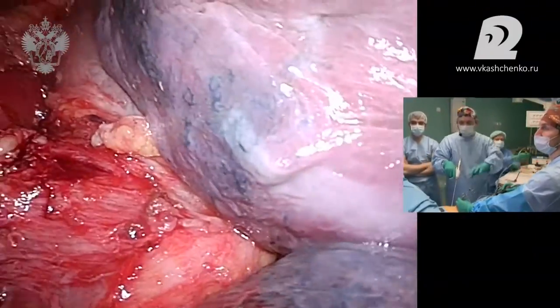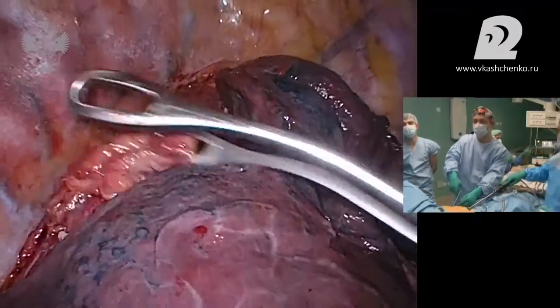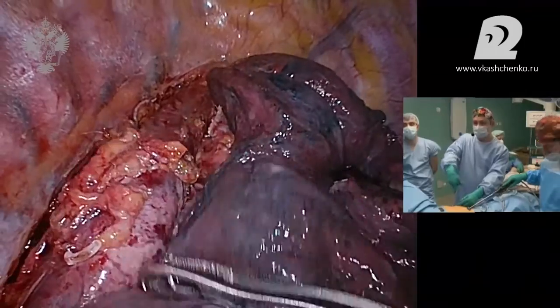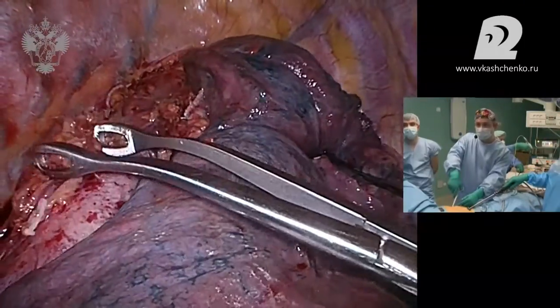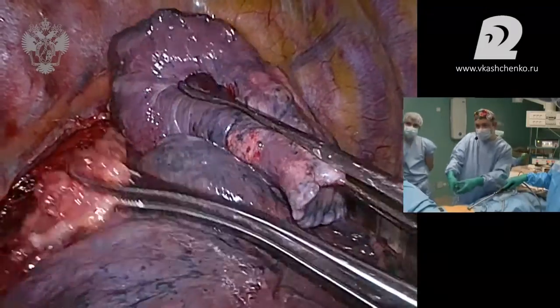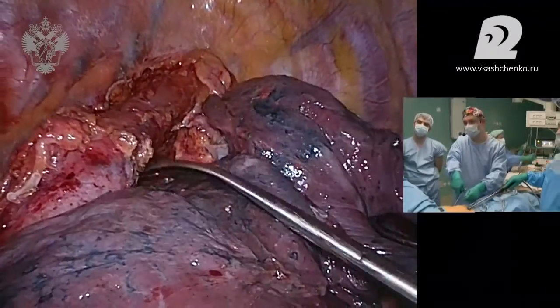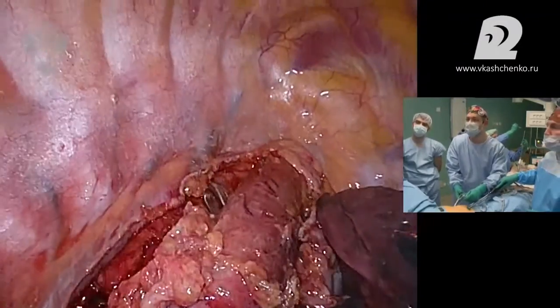Женька, подожди, это уже, наверное, вывернутая наизнанку обратная сторона. Назад ответим. Хорошо. Давай, заходи, братан. Пора уже, надо отсечь, конечно, наверху этот самый пищевод. Я тогда ее сейчас поставлю. Жень, это противоположная сторона, она уже хорошо сделана вся. Все, вот смотрите, мы просто ее полностью обошли.